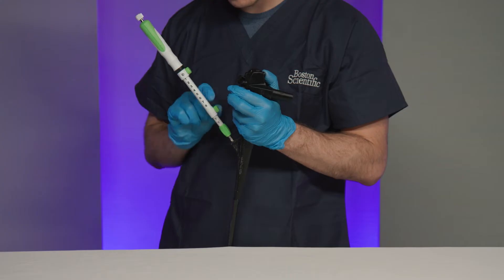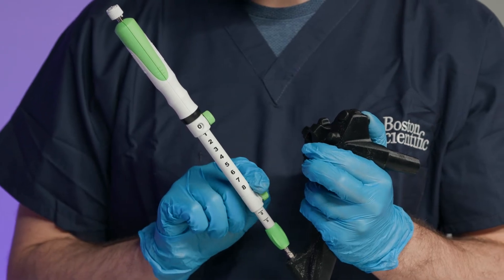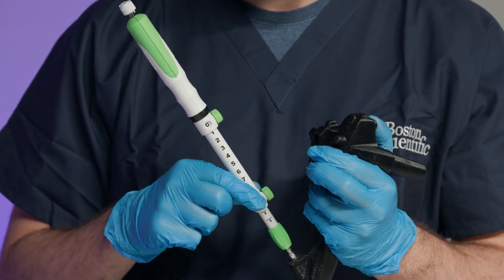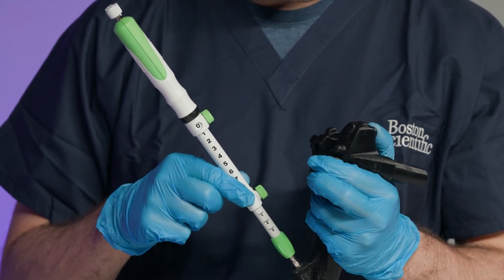Verify that the device is now securely attached to the echoendoscope. If it is necessary to adjust the sheath length, loosen the sheath adjustment lock and reposition it to the appropriate reference point. The device is now ready for use.